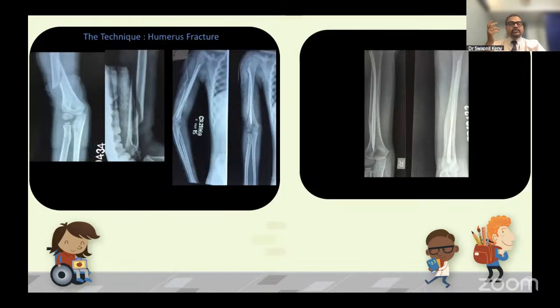In today's day and age, we have been able to treat most of the diaphyseal fractures in children with minimally invasive surgery. Now, I do not recommend fixation for humerus fractures in children. Most of them can be managed conservatively. However, there are certain situations where you require nailing fixation. This was one such case where there was a compound wound which required debridement and, of course, fixation. I had the option of putting a fixator, but other than an internal compound wound, there was no contamination.